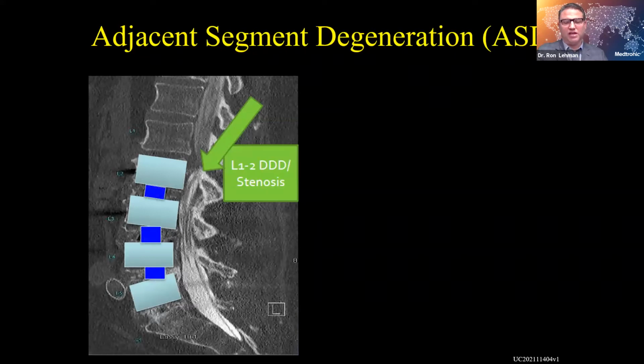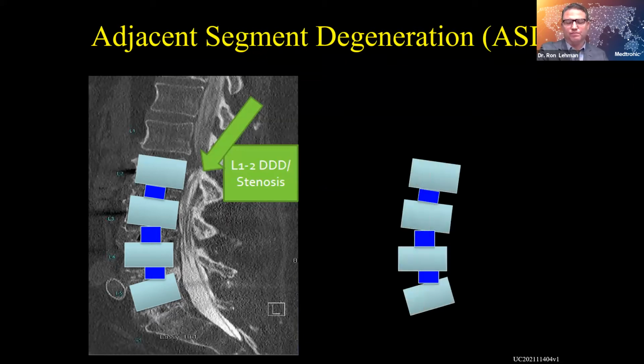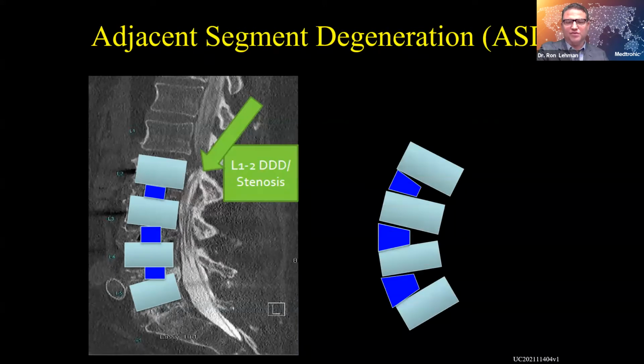So we can see here with 3 laterally based procedures, those cages are placed right in the middle of vertebral bodies. And no different than when you were a child playing with building blocks, if you stack 9 blocks on top of each other, you can't get it to tilt, right? So you need to make these either trapezoids or do something different. So this is what this particular surgeon ended up with, but what they were really trying to achieve was something that looked more like this. So by restoring lordosis, maybe we can decrease that risk of adjacent segment degeneration. And that's really what we thought until the last few years. And now I think we have some evidence that speaks to that.